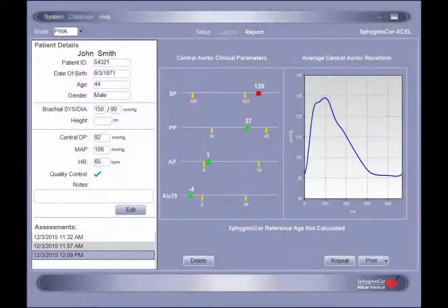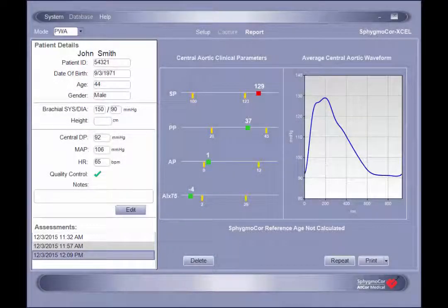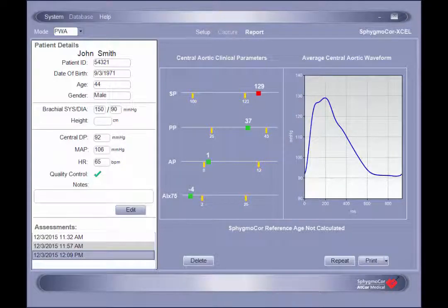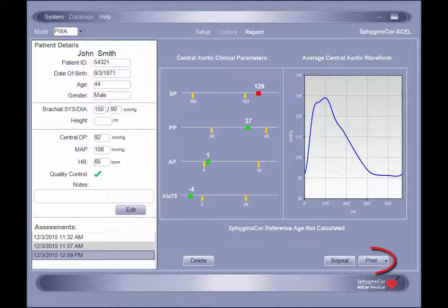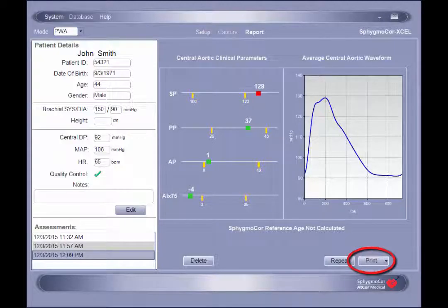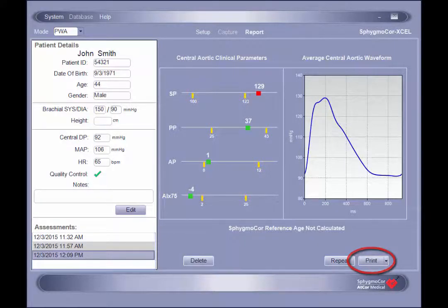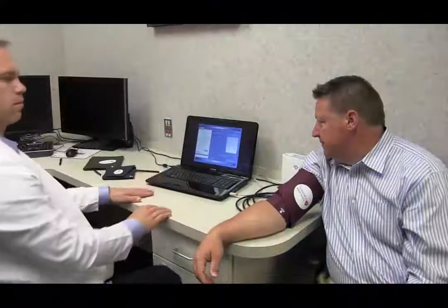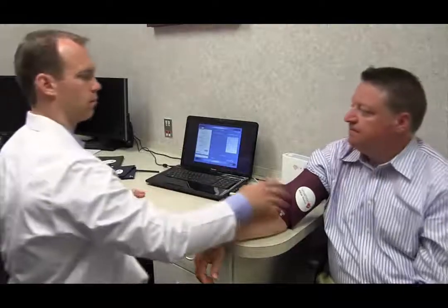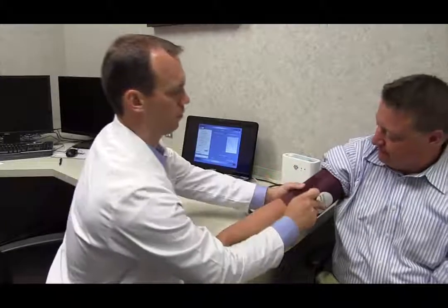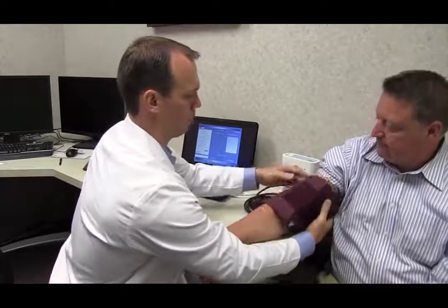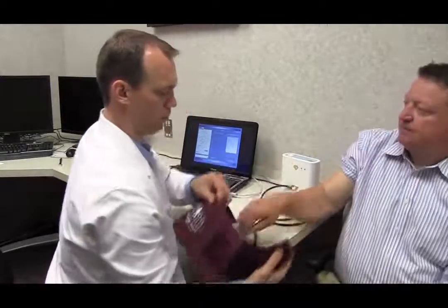If the computer has been configured with a printer, it is possible to print a hard copy of the report by clicking the print button in the lower right-hand corner of the screen. Once an acceptable report is obtained, pulse wave analysis is completed and the cuff can be removed.